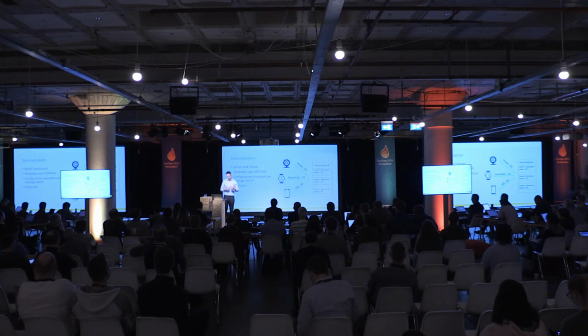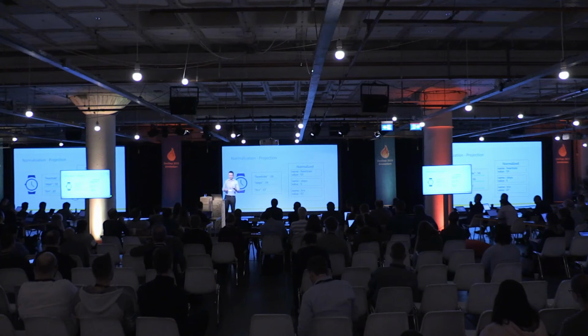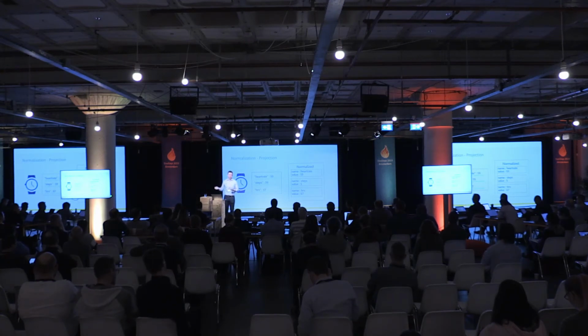And then lastly, one of the things that we do is a projection. So on the next slide, I have an example of really what that looks like. It's fairly common in devices where they'll send a payload where you'll have multiple measurements of different types in a single payload. So one of the things that we'll do for you is, with the templates, you'll set up 3 templates to look for each of these, and we'll extract and parse that one message into 3 in this case. So we had one message that had heart rate, steps, and heart rate variability, and now we've split it out into 3 where we have an individual heart rate, steps, and HRV. And then those can go on to be separate observations created in FHIR.